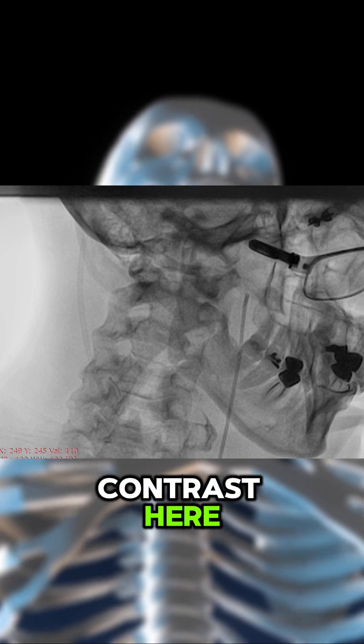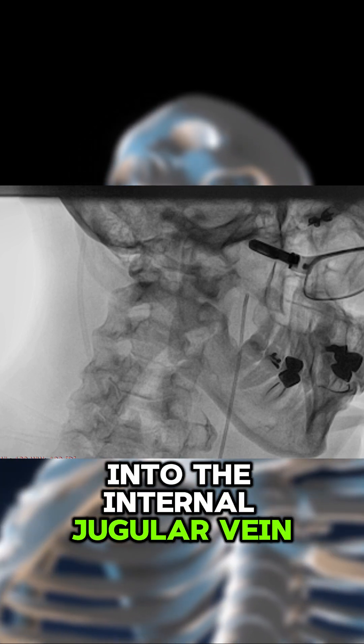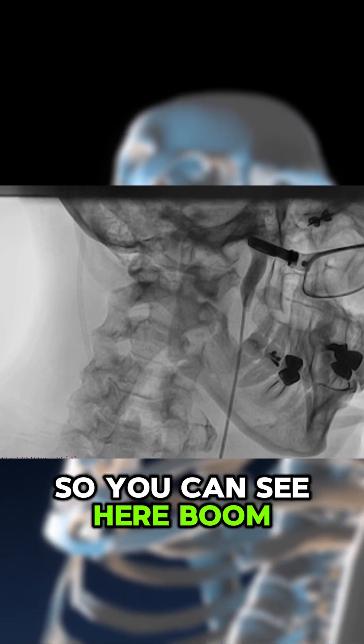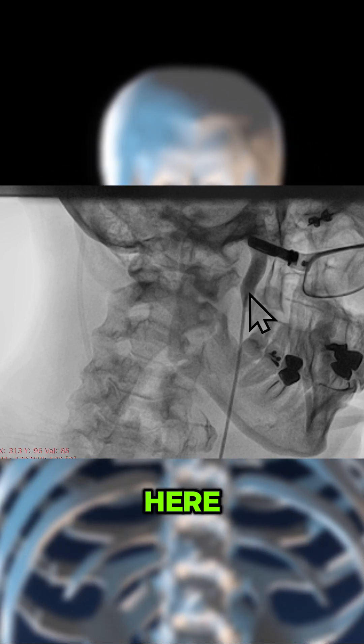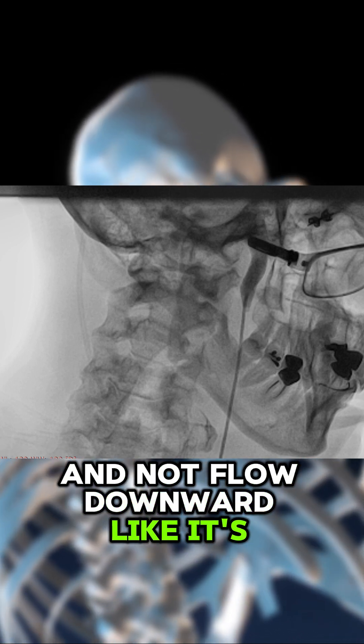They're going to squirt some contrast here into the internal jugular vein. You can see here — boom — they just squirted the contrast, but the contrast is going to stay up here and not flow downward like it's supposed to.